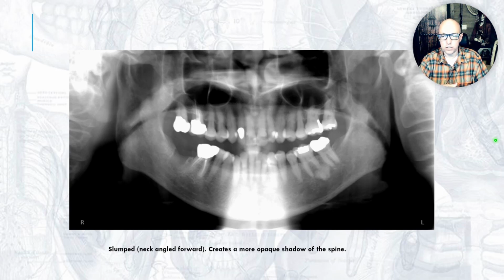Come to me if you have questions, if you can't recognize things, because you should be able to identify every little object that you see in a pano. Take advantage of the fact that you can just email me and I'll look at it and hopefully give you a quick answer. But in some cases you may spot something that can affect the patient's life. So do take this seriously.